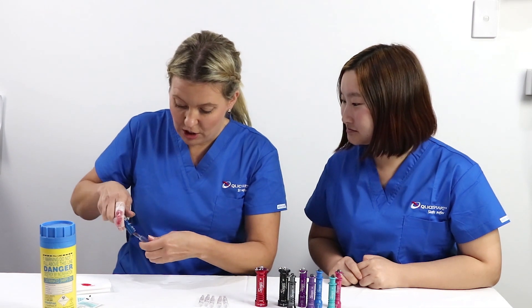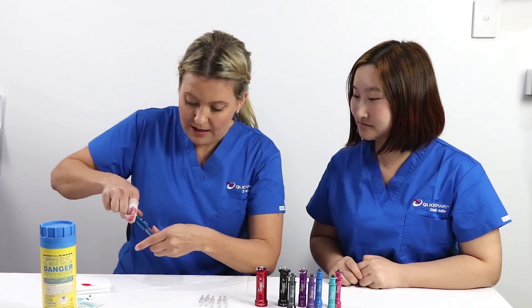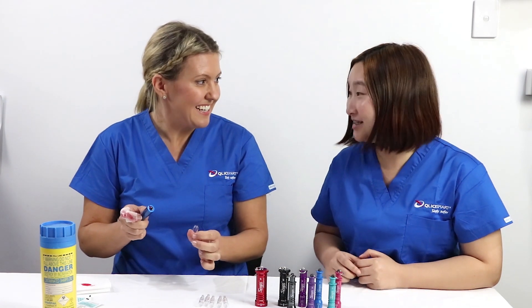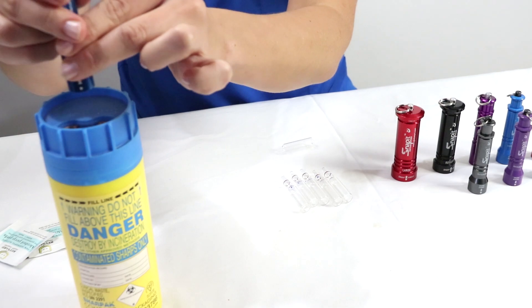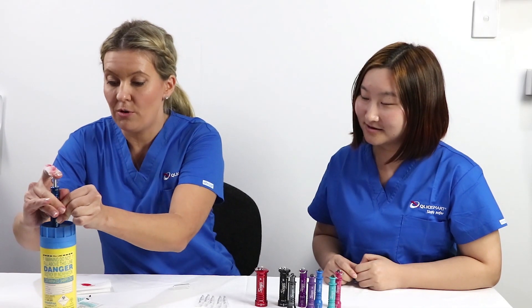Simply line up the dots, push it in, and snap away from you. It's quick and easy. To discard, hold over the sharps container and press down the rod.